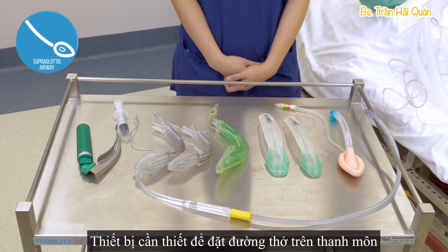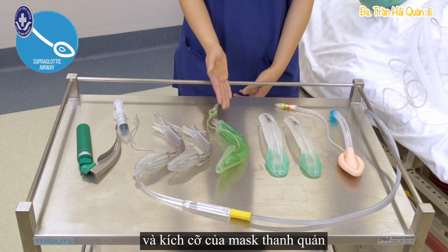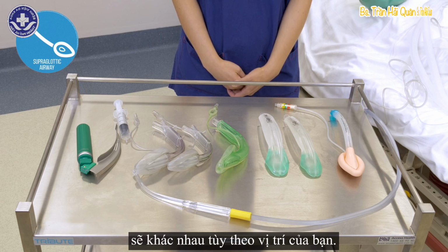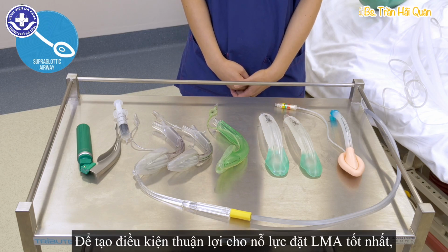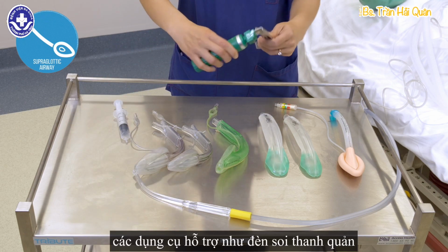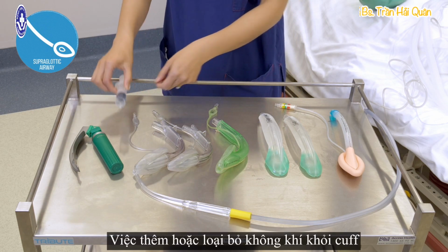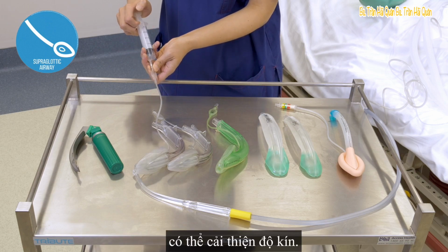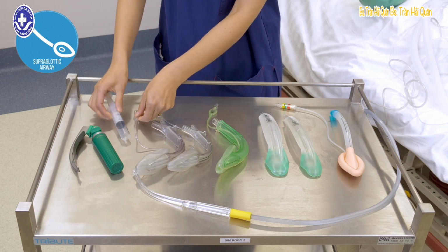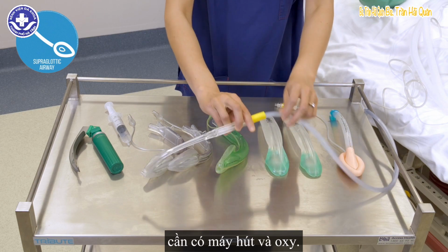The equipment required for supraglottic airway insertion will include a range of types and sizes of laryngeal mask airways, and the availability of each will vary according to your location. To facilitate the best attempt at LMA insertion, aids such as a laryngoscope or introducer can assist with insertion. Adding or removing air from the cuff can improve the seal. And as with mask ventilation, suction and oxygen sources are required.